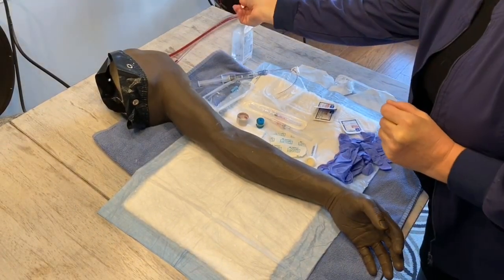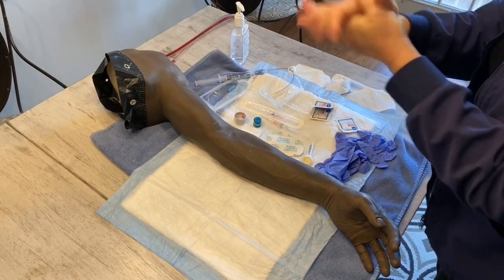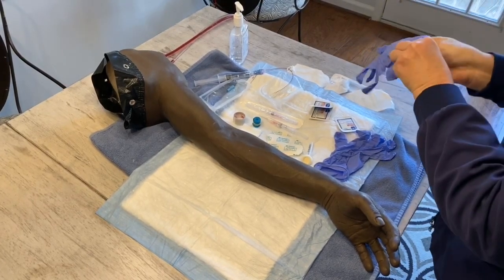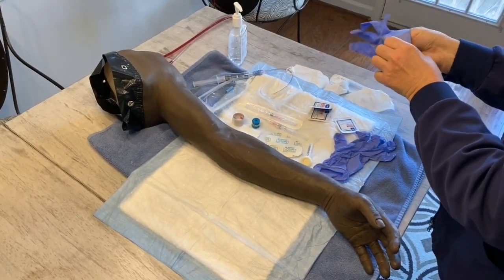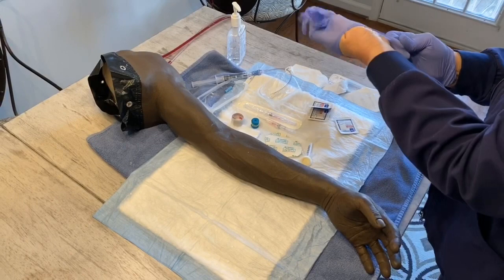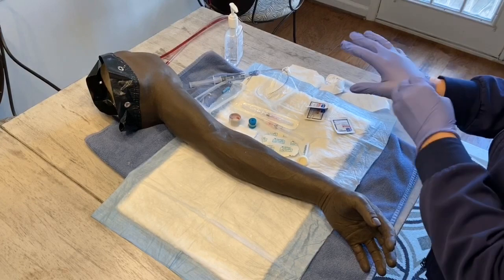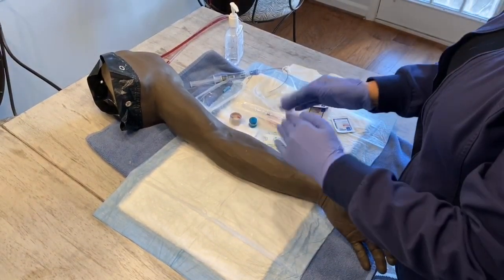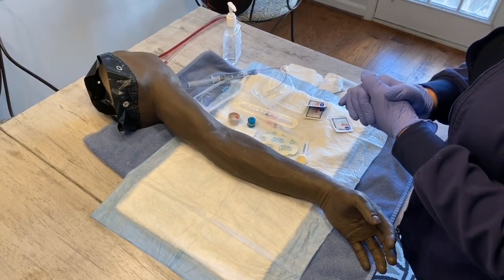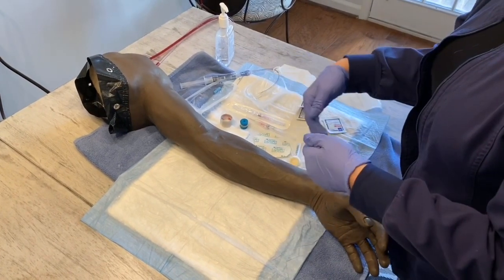Okay, first I'm going to wash my hands and apply my gloves. Remembering this is an aseptic procedure. Then I'm going to want to go ahead and assess the arm or the venipuncture site, looking for any excess hair. If there is any, go ahead and cut it with scissors or clip it with clippers, but do not shave. There's nothing, this side is fine.